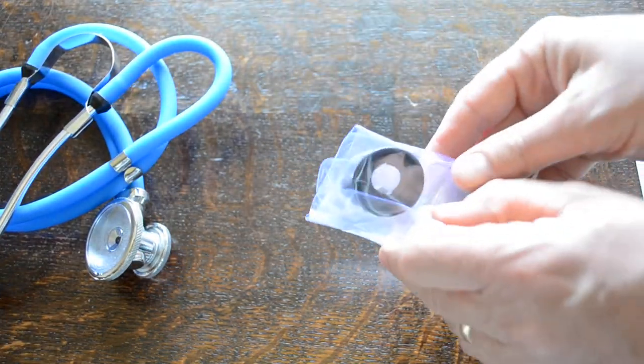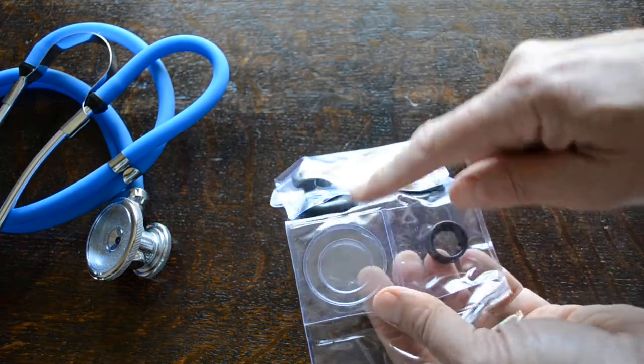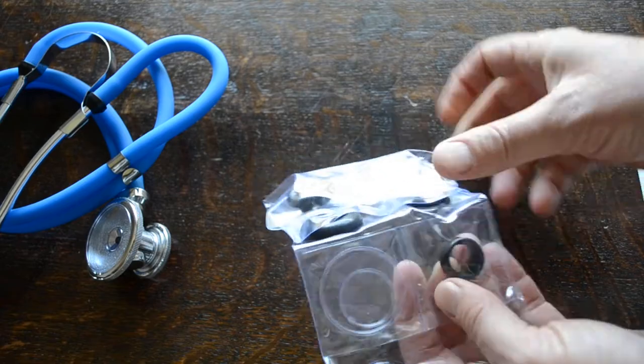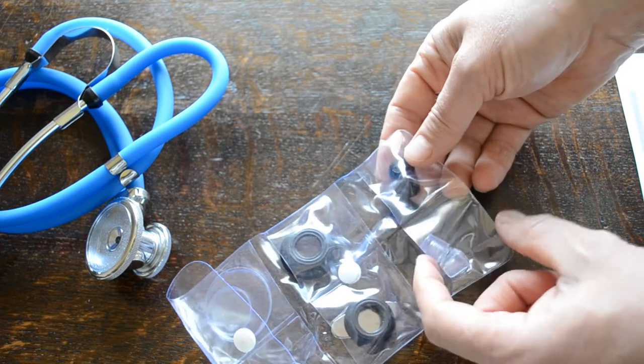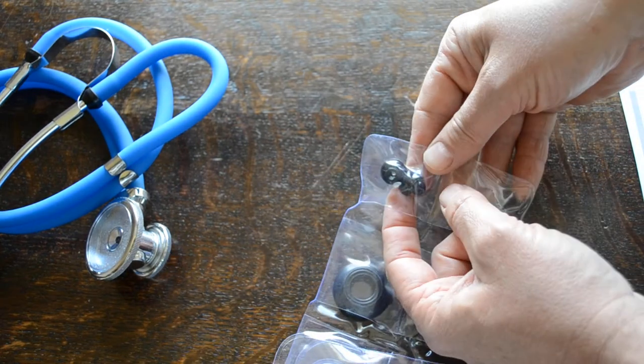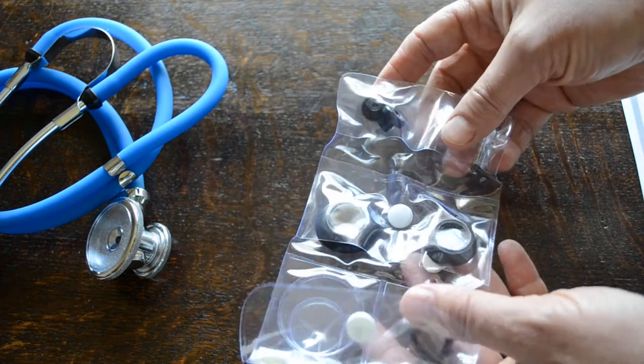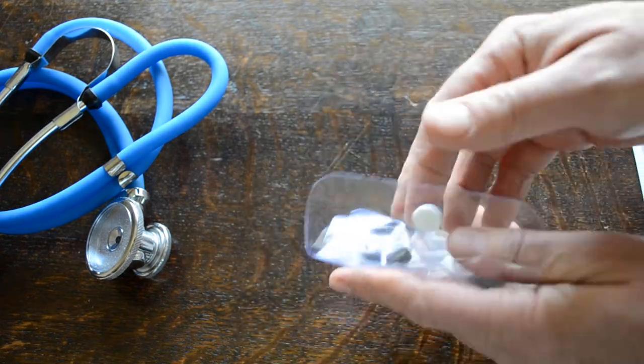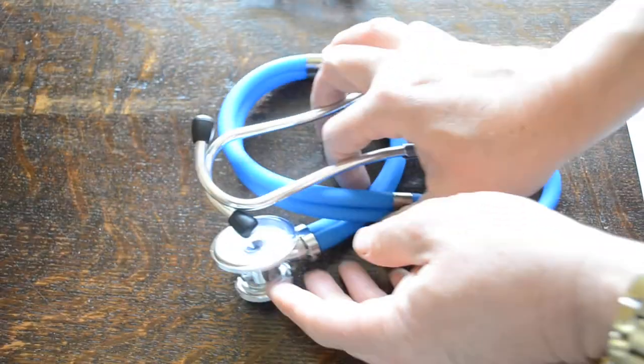I'll just show you the spares pack that comes with each of these blue units. You get two spare diaphragms, a neonate bell, paediatric bell, and an adult bell. A spare set of soft translucent ear tips and a spare set of button ear tips if you prefer those as well. So a very good quality pack of spares comes as standard when you buy the stethoscope.